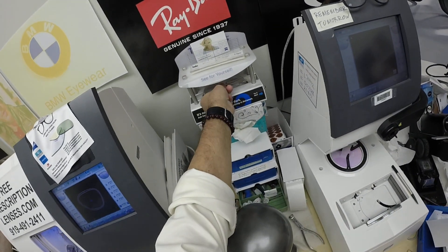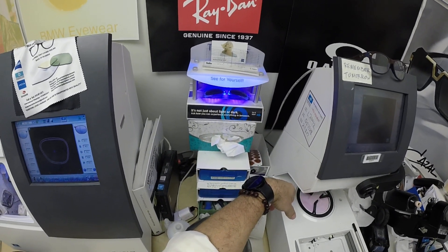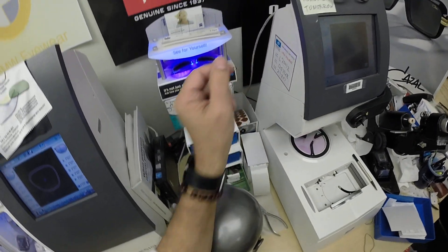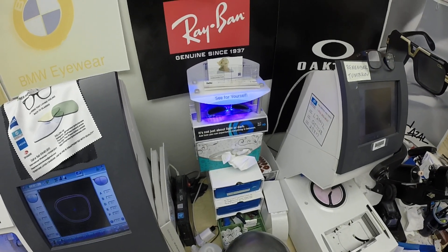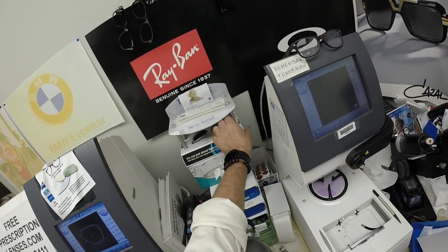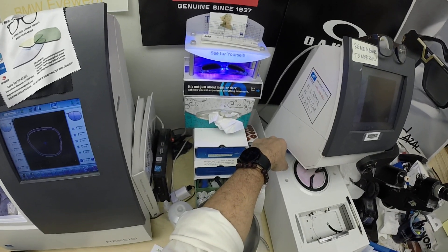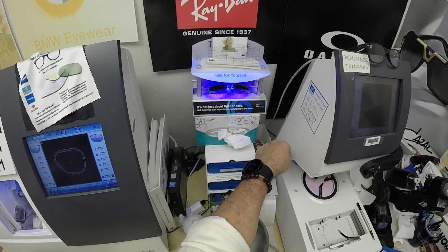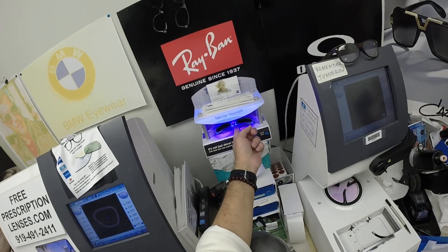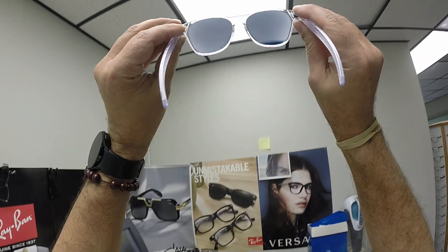It takes about 30 to 45 seconds for the lenses to turn dark, and a little bit longer when you come back inside — 30 to 45 seconds to a minute, maybe a minute 15, to return back to clear. All photochromic lenses get dark on day one and continue to darken every day for the first couple of weeks they're exposed to the sun. After that, they work for years at maximum performance. The only time they don't work perfectly is if you're behind the windshield of a car — your windshield absorbs the sun's harmful ultraviolet rays.